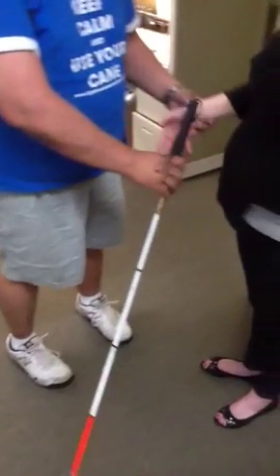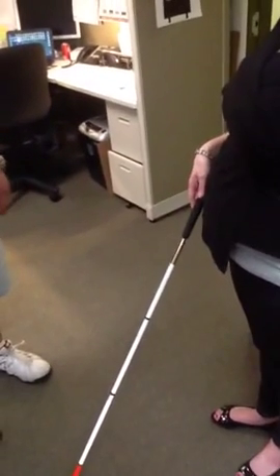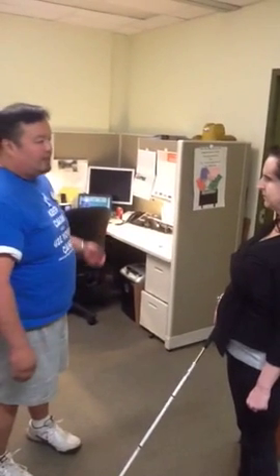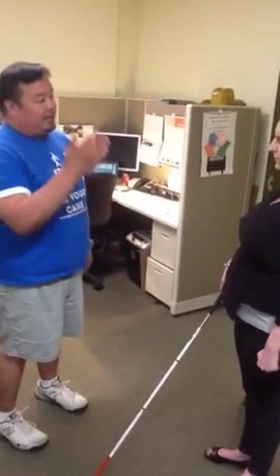And the reason we're going to work on those three is because I'm going to show you how to travel using a diagonal technique. A diagonal technique is used indoors when you're going down a hallway or cubicles. But what it's designed to do is protect your body.